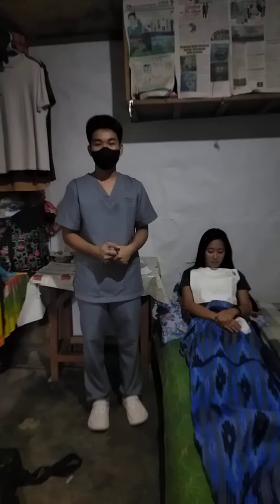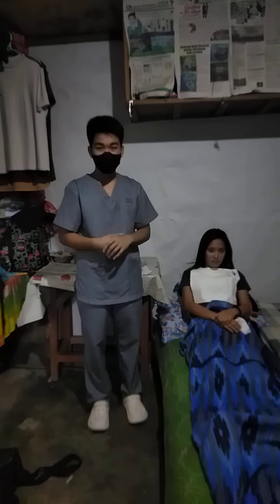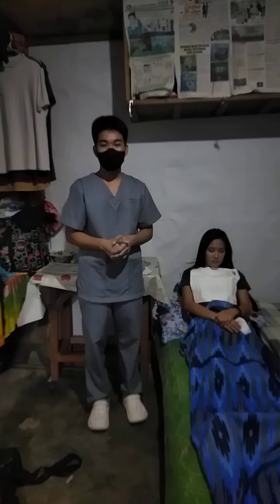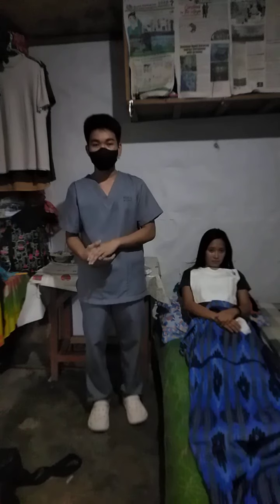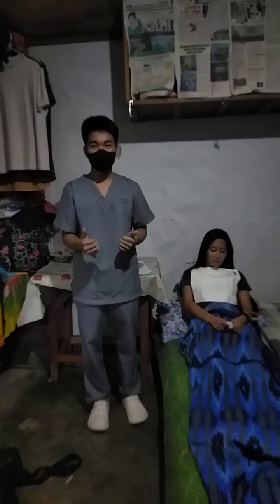Then after that, document all relevant data: record the removal of the tube, the amount and appearance of any drainage if connected to suction, and any relevant assessments of the client. And that's all for the removal of the nasogastric tube.